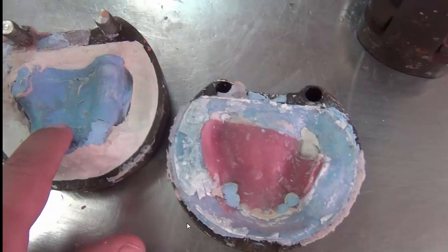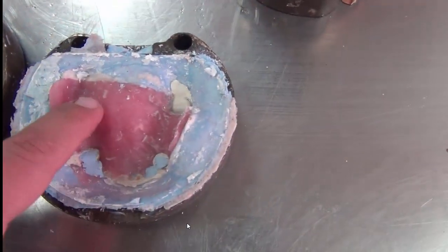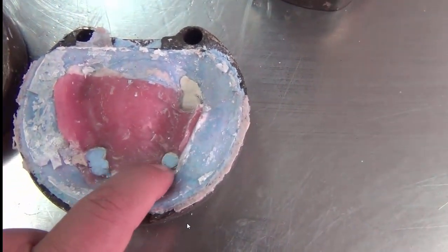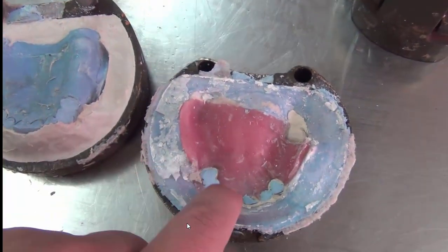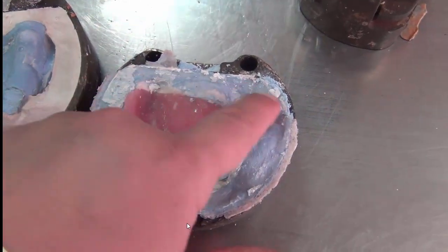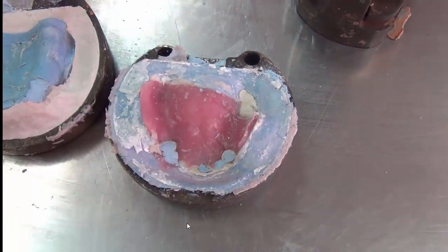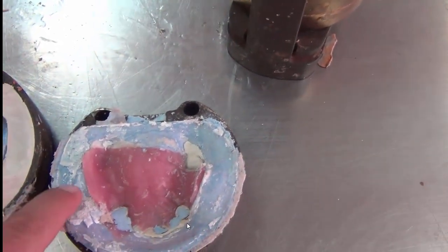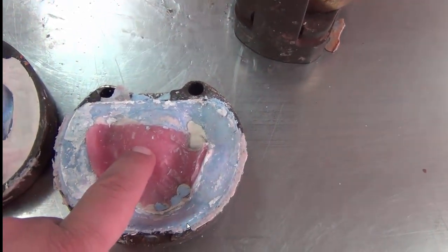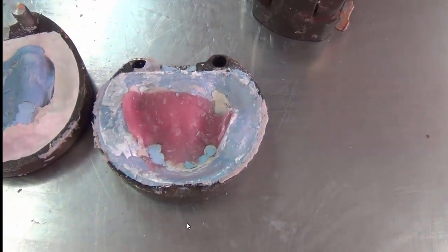So we will take out this cast, and we have the denture on the other side, and we have the wires embedded in it. Part of the abutment teeth fractured off the cast. This is okay, and we have the stone intact. Now this is the critical stage where we need to make sure that while hammering off this stone, this denture does not break. So this is why we need controlled forces.